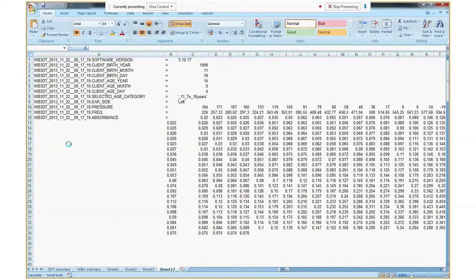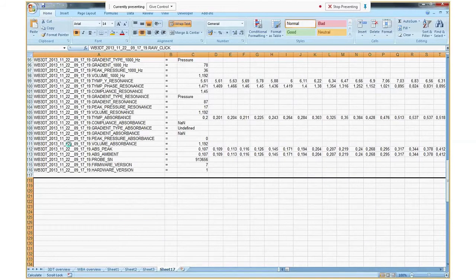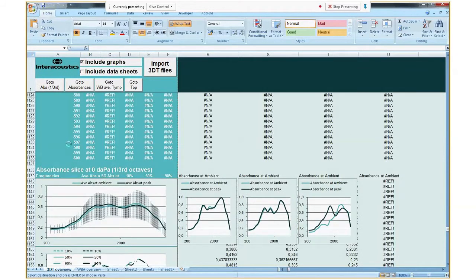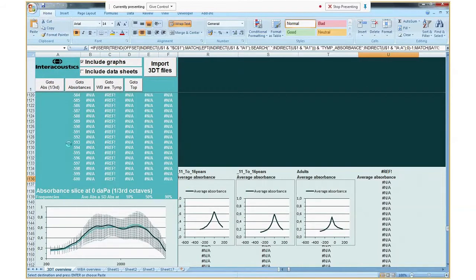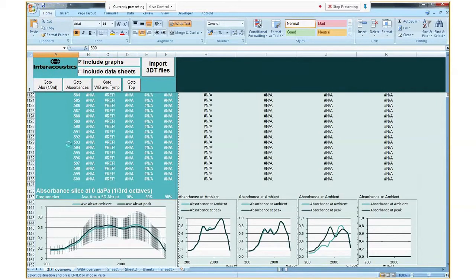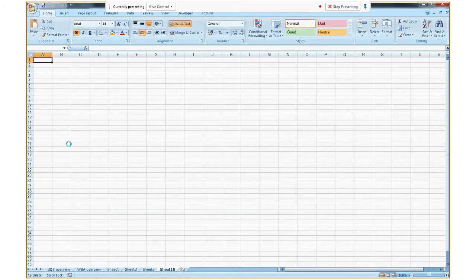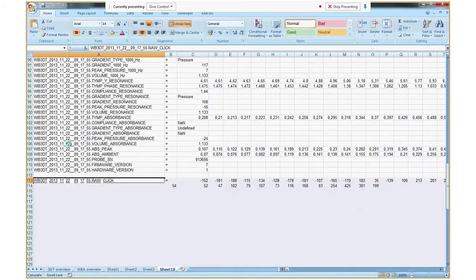With absorbance measurements, it is most common to work with percentiles, not with standard deviations, because there is a limited range. The absorbance will be between 0 and 1, and that means that standard deviations do not work if you get close to 0 or close to 1. Then it's not an appropriate measure. And therefore also the normative data that is used in the Titan is all based on percentiles.